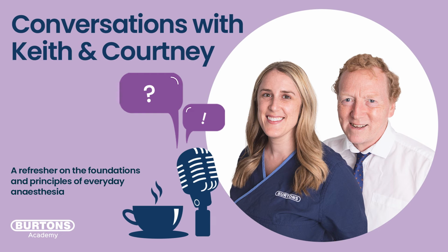So if you see molehills, basically something is wrong with the assessment technique of the capnography. Basically, the equipment is too big for the size of animal you're actually trying to monitor. And then we have to be very careful, because we still get an end-tidal value reported by our capnograph, but it's a falsely reduced one. So it looks quite good, only about 35 or 38 millimeters of mercury. But if we've got molehills, the real value could be anything, and we have no way of predicting what that could be. It could be as high as 50.